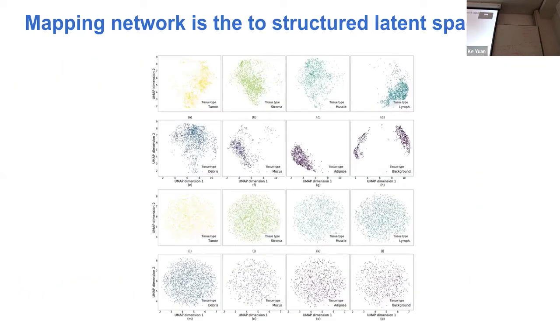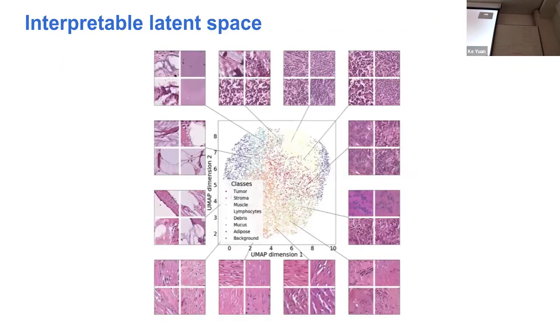In this particular case, we don't have that for breast cancer, but the cancer cell count, in a way, approximates that. You have less cancer cell count. We didn't have the numbers for lymphocytes, but in the second half of my talk, I will show some results.